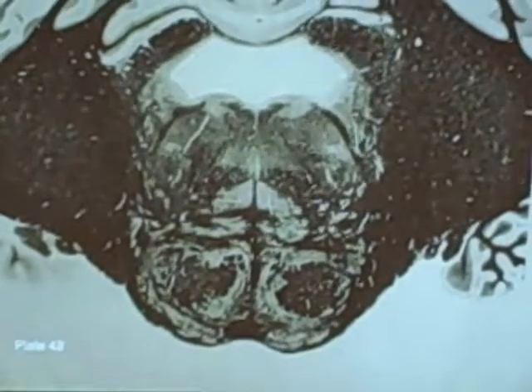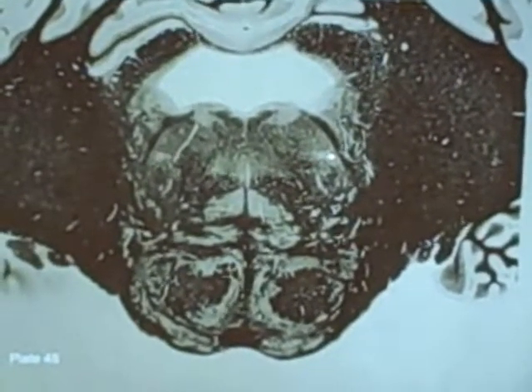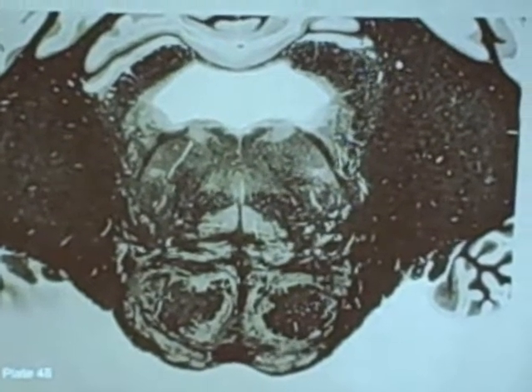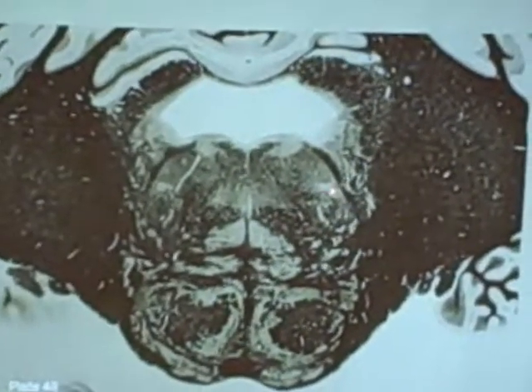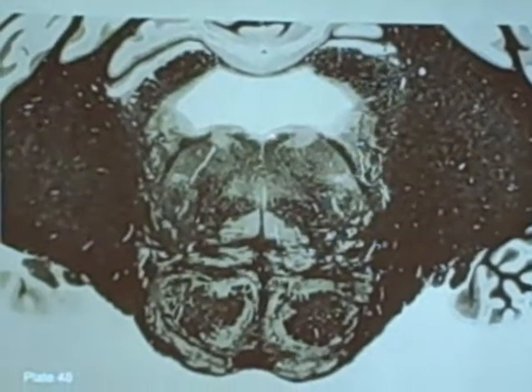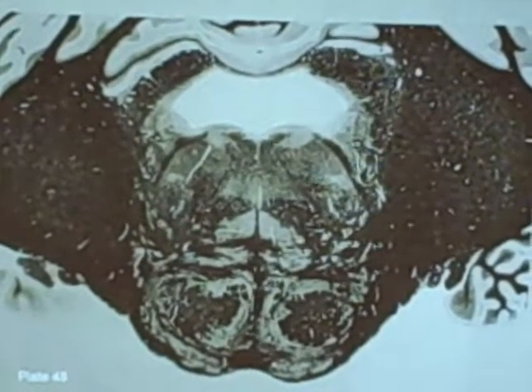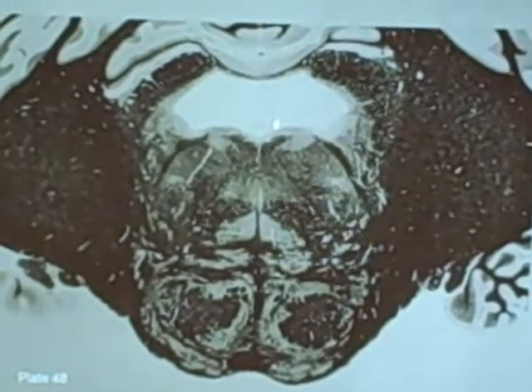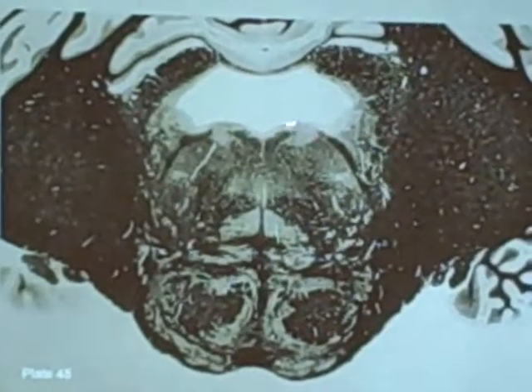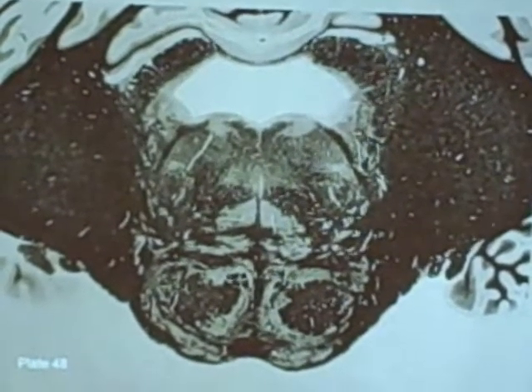All right, now the other thing that you can point out here is there's another nucleus coming in here, and this is the facial nucleus. And the facial nucleus gives off the facial nerve fibers, which come around and actually wrap around this nucleus up here, and that's the sixth nerve, nucleus abducens. So 6 and 7 are located right next to each other, and that's why when someone has a stroke or a mass lesion growing in the Pons, 6 and 7 tend to be involved together.